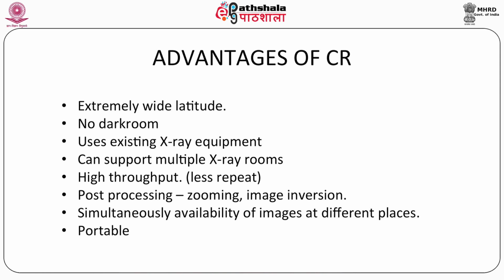Now, the advantages of CR plate. It has extremely wide latitude, and there is no need of any dark room. It uses existing X-ray equipment, conventional X-ray units, and can support multiple X-ray rooms. So there is high throughput and very few repeat exposures. Post processing, zooming, image inversion is possible. It is time saving, and there is simultaneous availability of the image at different places.